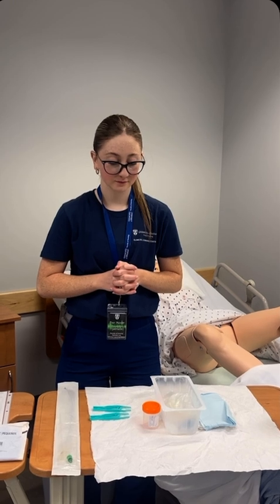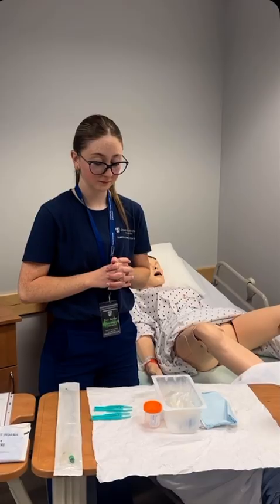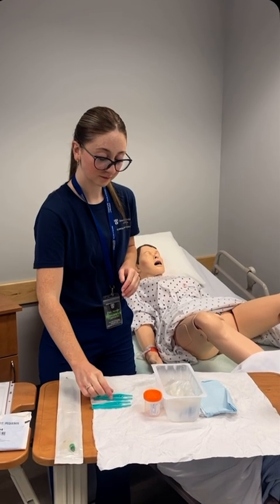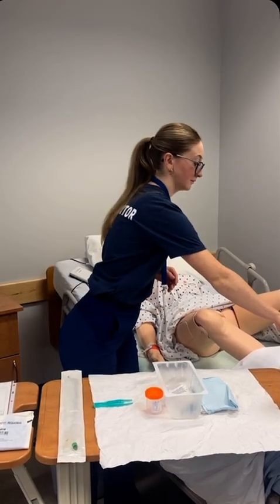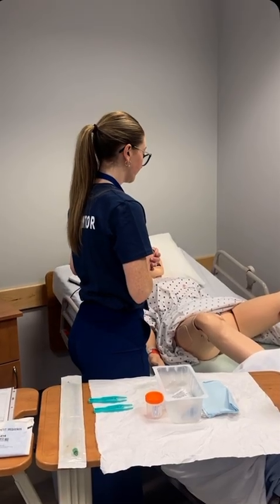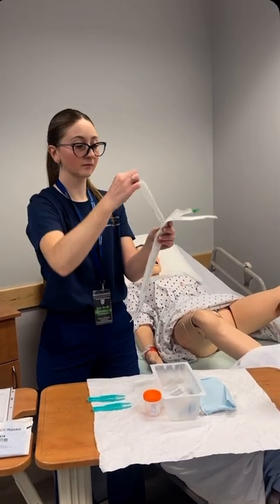Sets up sterile field correctly using outer forceps. Must not cross hands or arms over sterile fields and put tips of forceps inside the 1-inch border. Removes garbage bag and sets up proper working triangle. Garbage bag is within reach of working area but preventing cross-contamination. Place catheter on tray correctly, maintaining sterility.